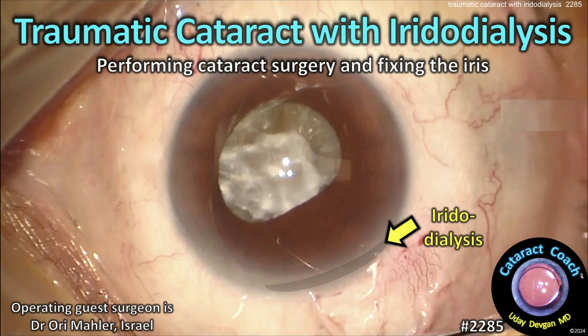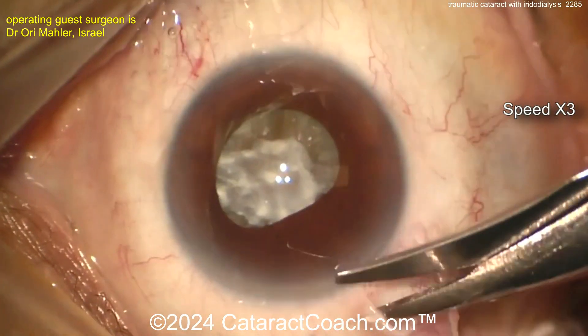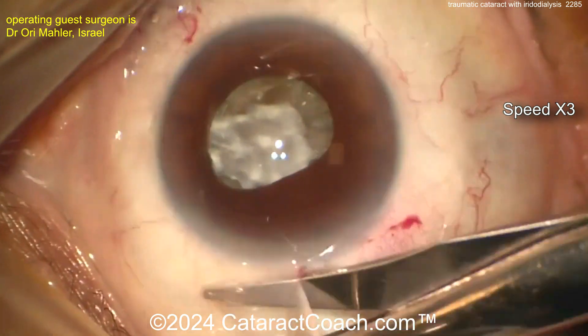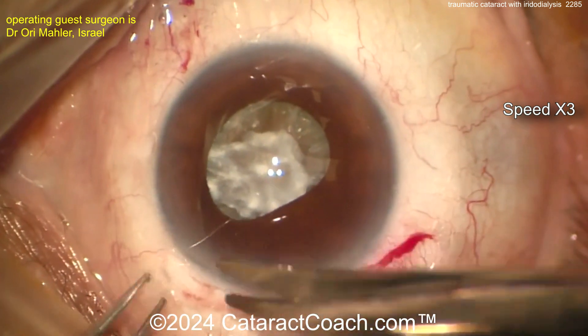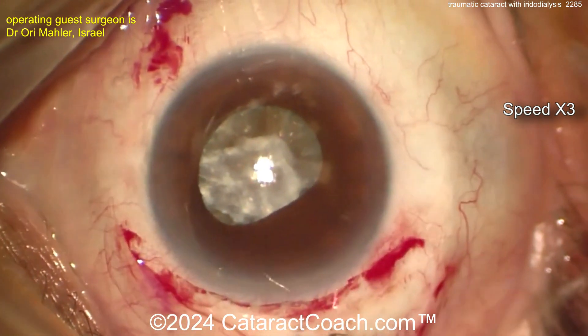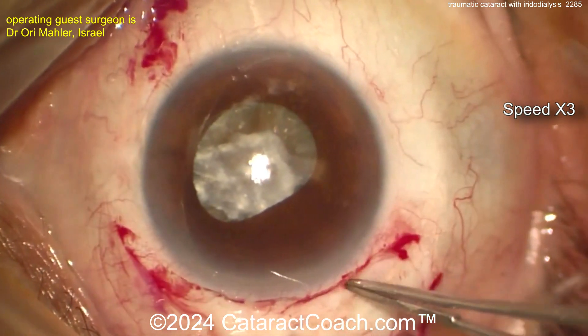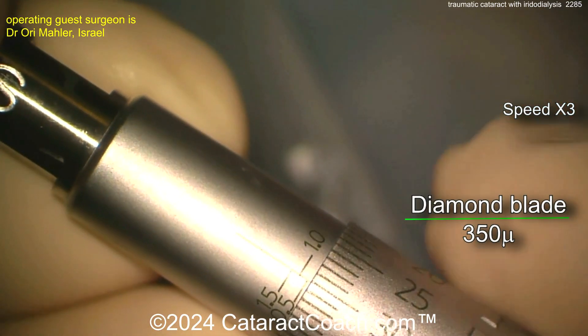Cataractcoach.com: traumatic cataract with iridodialysis — performing cataract surgery and fixing the iris, it's a tough case. Trauma is always tough because you never know what you're going to get into. Here the surgeon is making a peritomy, sitting superiorly, and you can see the pupil is kind of D-shaped or oval-shaped because of the iridodialysis. Getting a little bit of cautery done here.